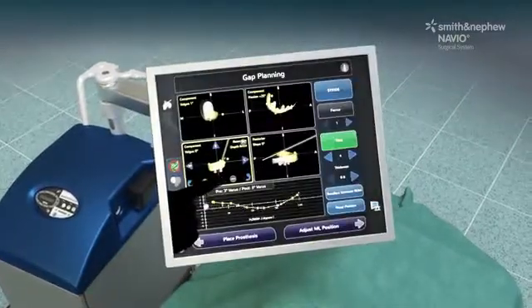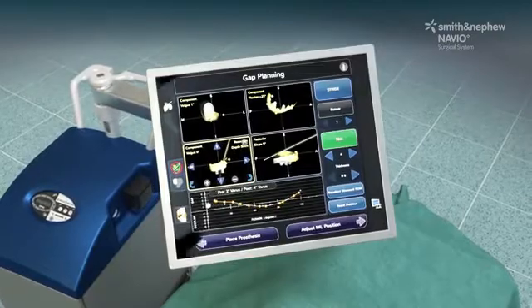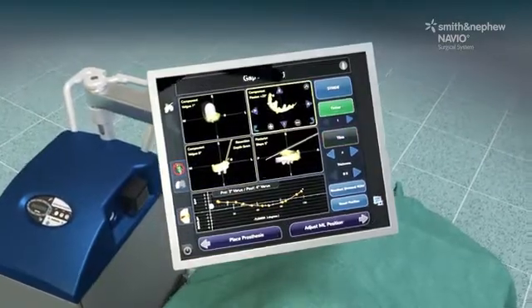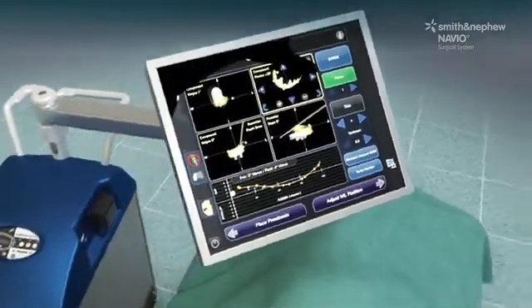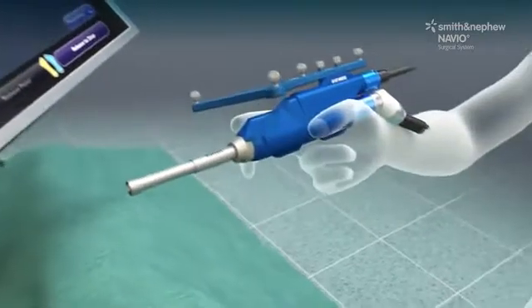Advanced planning software allows the surgeon to virtually position the implant and balance soft tissues throughout the full range of motion prior to bone resurfacing.